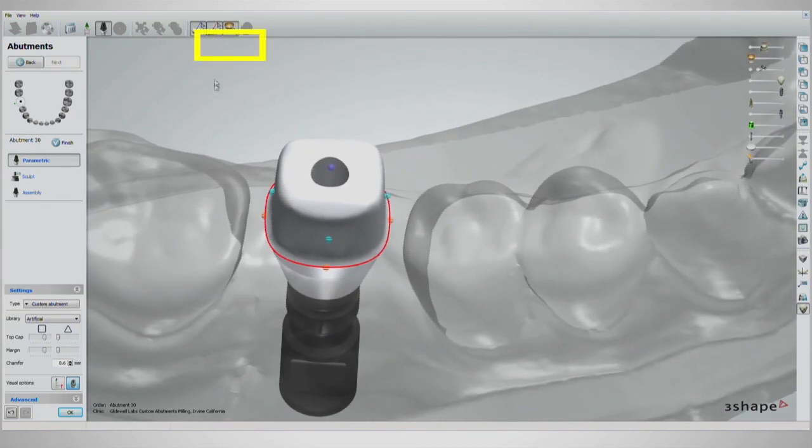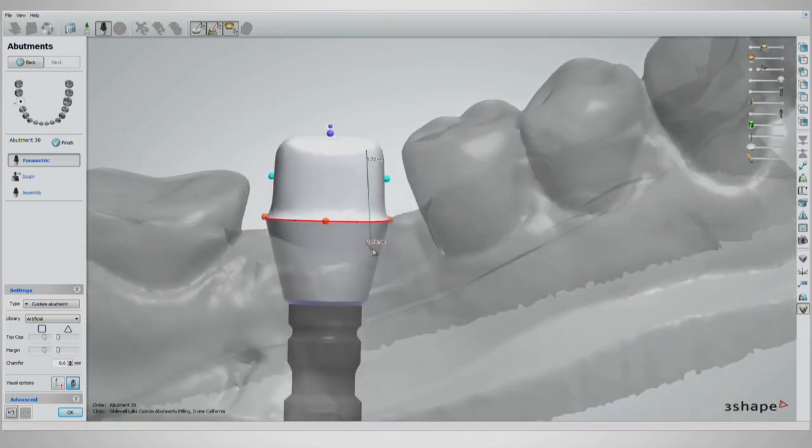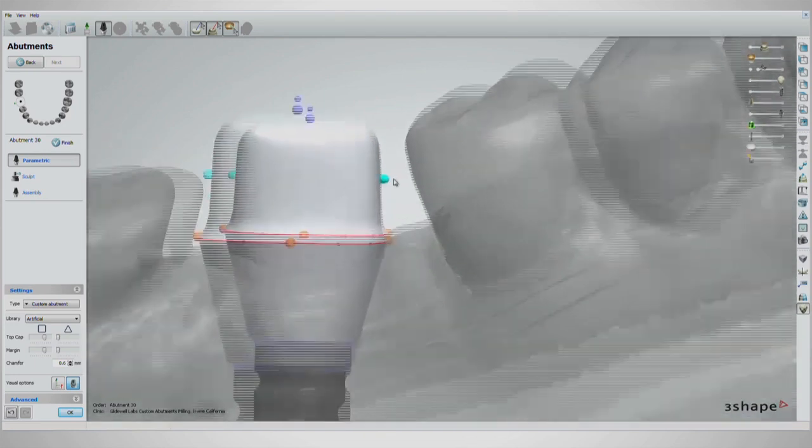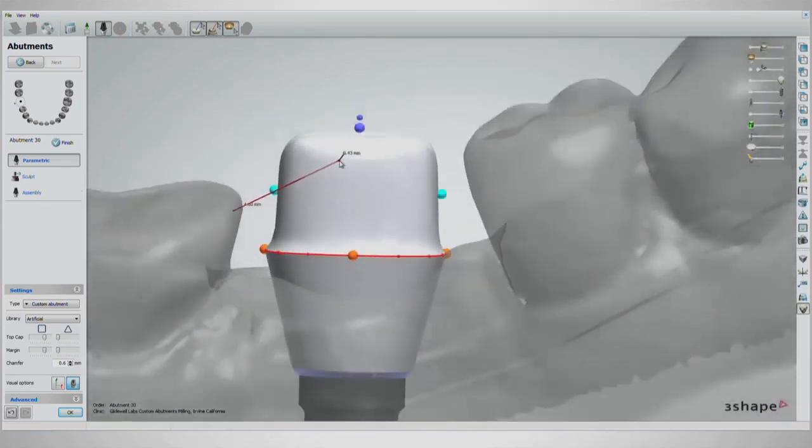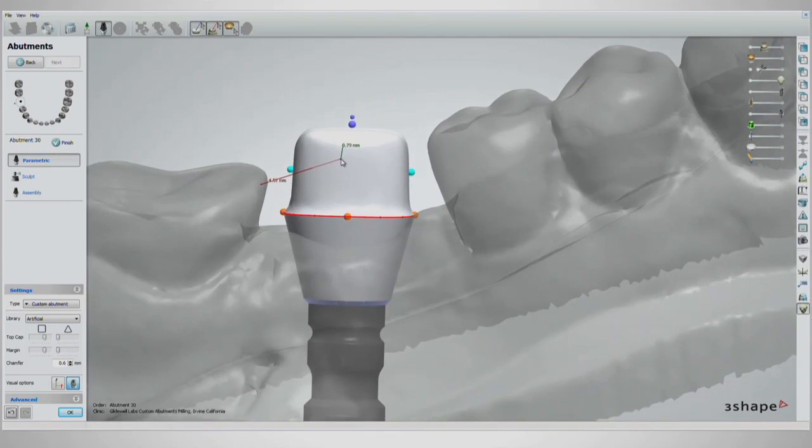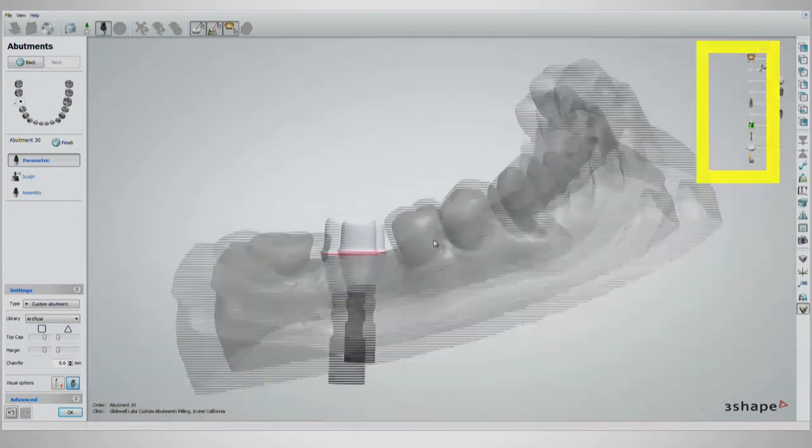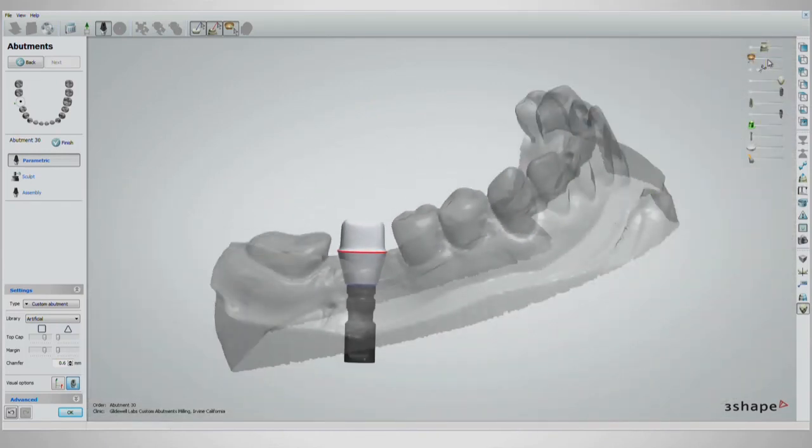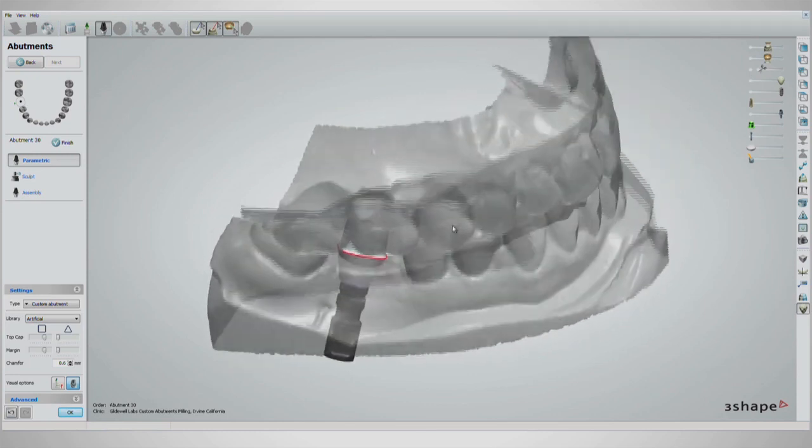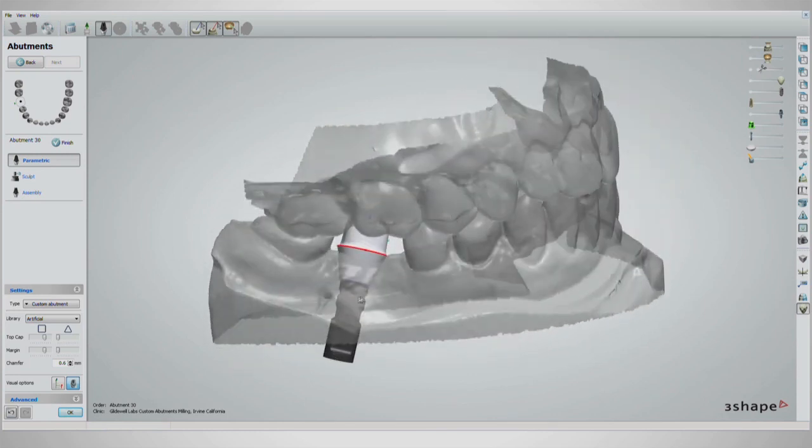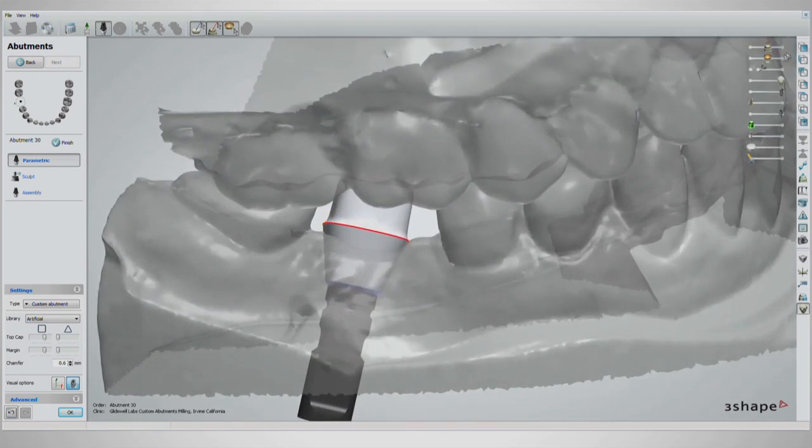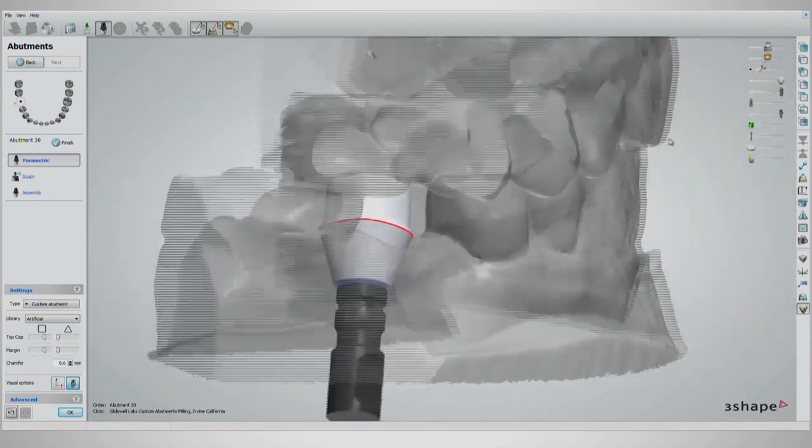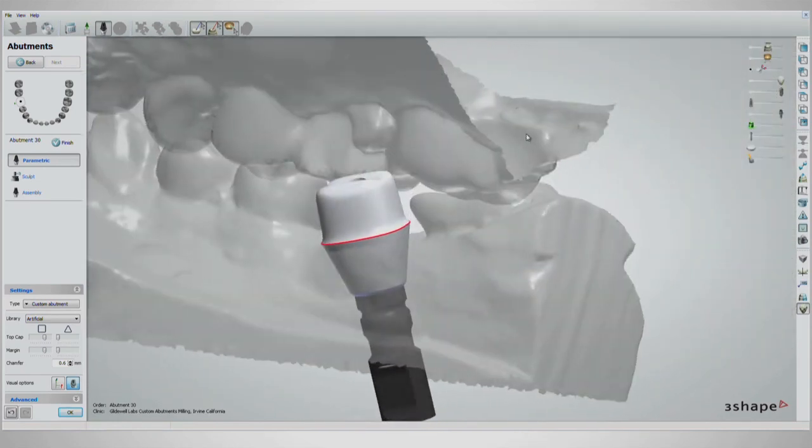In the top bar, there are three tools that are best left activated throughout the whole design. They allow visibility of real-time measuring. On the right side of the screen, there are transparency handles that allow you to view each component on the on-screen design, independent of one another. The opposing arch, screw, implant, and scan abutment can all be shown or hidden with the sliders.